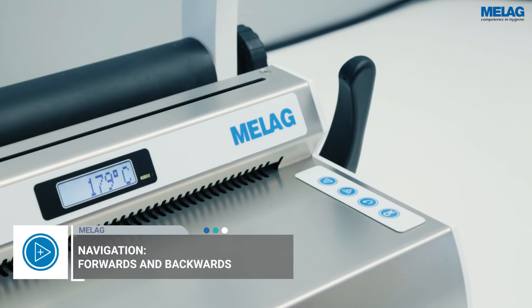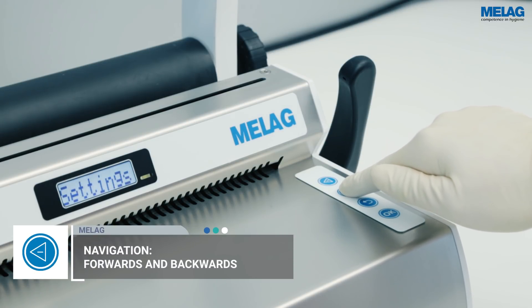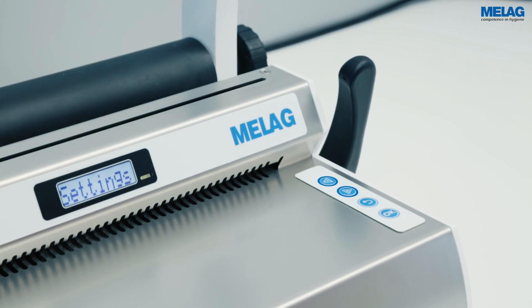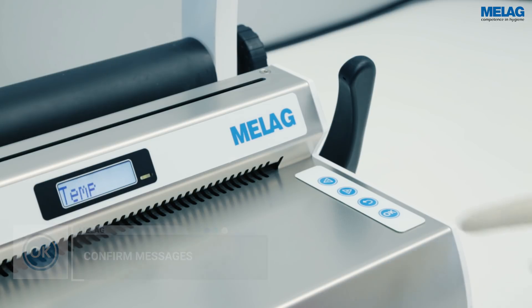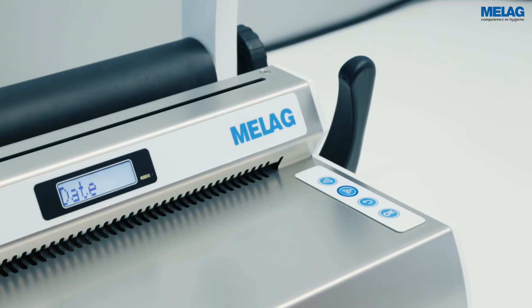Navigate through the menu using the plus or minus keys. Please select the menu item Settings by pressing the OK key. Then navigate to Date and confirm your selection with OK.